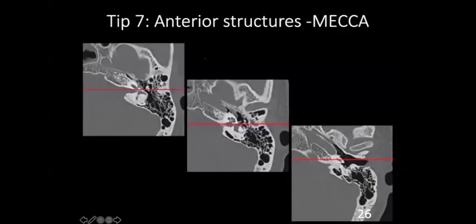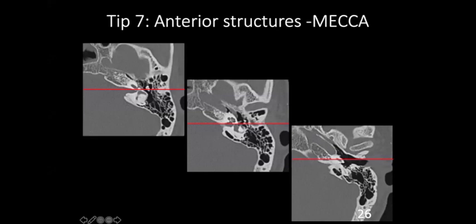One more orientation — I call this MECCA. What are the anterior structures in the temporal bone? Looking at the mesotympanum anteriorly and drawing a line to the middle of the vestibule: first you see the head of the malleus — M of MECCA. Going lower, you have the Eustachian tube — E. Then Cochlea — cochlea is anterior and medial. At a lower level, you see the Carotid artery — internal carotid artery. And we have anterior epitympanum in the upper part — A. Remember the MECCA mnemonic for all anterior structures.